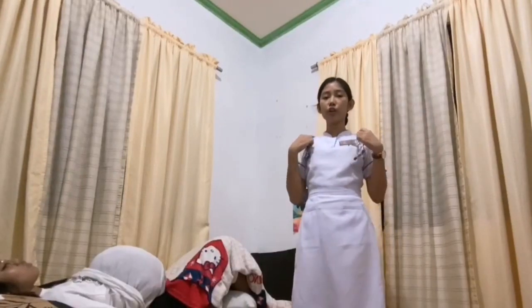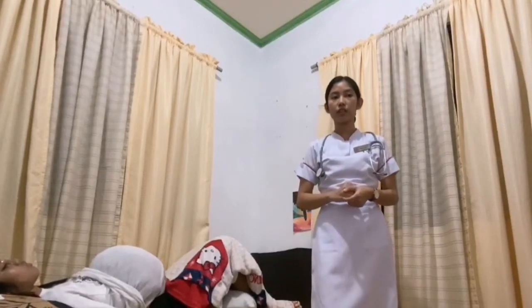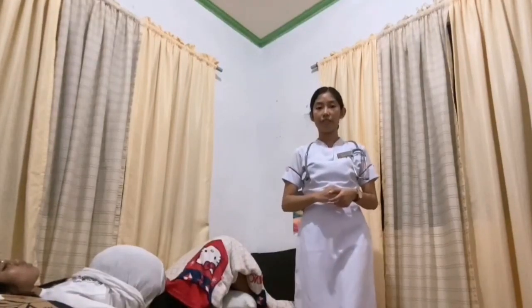So after 1 minute, the normal FHT is 120 to 160 beats per minute. Note the location, rate, and character of the FHT. This is in order to monitor and evaluate the condition of the fetus.